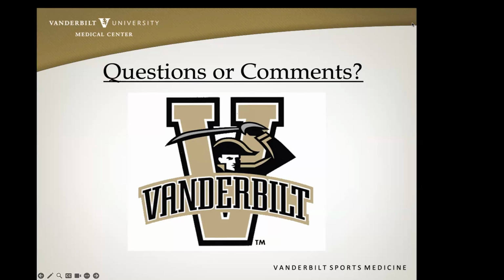And then the last thing is, when these patients come in subacutely, I always try to make sure I don't see any evidence of a DVT as well, because I've seen a couple of athletes who have had gastroc tears, and older adults with gastroc tears, that then also have a co-development of a DVT. So just keep that protocol in the back of your head as well. That's certainly something a lot of us are not super comfortable with from a scan standpoint. I know that's something we're doing at the advanced course at AMSSM this year, so anyone who's interested in learning more about that should think about that.